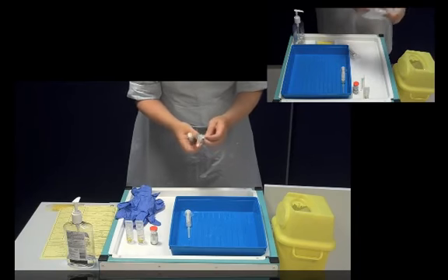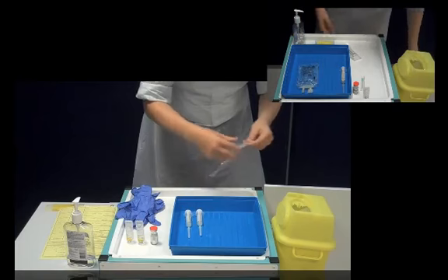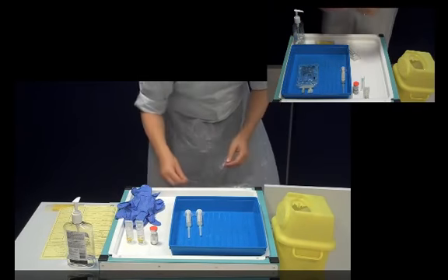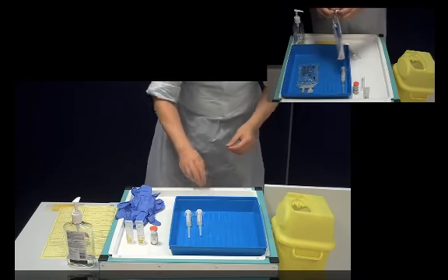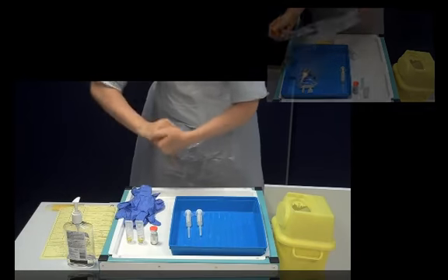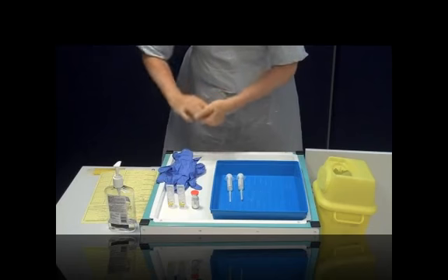If you're going to give your antibiotic via an IV infusion rather than an IV injection, then at this point open up your bag of saline into your ANTT tray and do the same with the IV infusion set. Once you've done that, wash your hands.